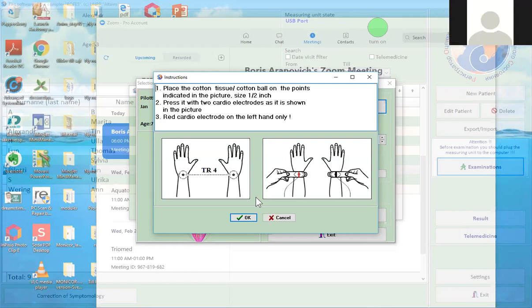Hi, it's Shavana. I was just checking if there are any updates regarding the PDF, saving files. Professor Alex says this update will be done in March, so you need to wait several weeks. Is there any way that we can view files that are saved in the FP3 format? I sent you an email today with a link to a program which can read FP3. You download and install this program, and then you can open these reports, read and print them out also. Oh, fantastic. Thank you.